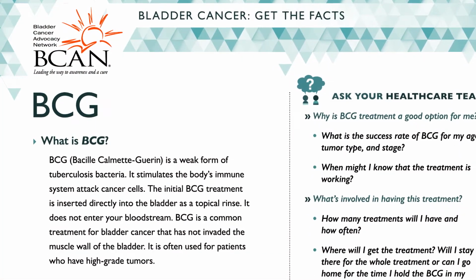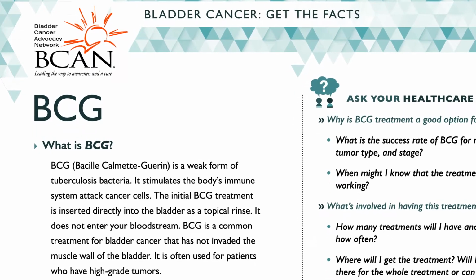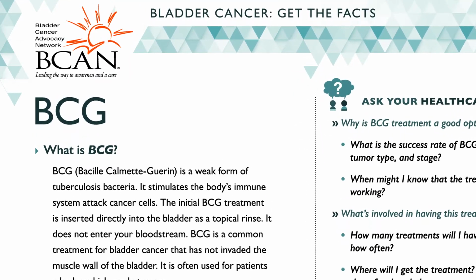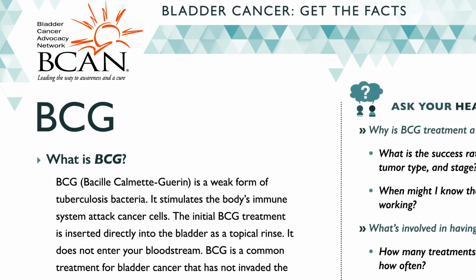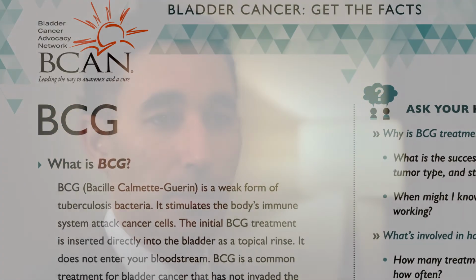So another important aspect of the study was that we had to wait a minimum of 6 weeks before instillation of Cysview for evaluation under blue light for patients who had undergone BCG therapy or any intravesical therapy. That's perfectly in line with what we do in clinical practice. Previously it was thought perhaps we need to wait 90 days or 3 months to let the inflammation settle down to decrease false positive rates, but fortunately we saw that 6 weeks was really an adequate time to wait, and it did not increase our false positive rates with patients who had undergone intravesical therapies. So that was important because it's perfectly in line with what we do in clinical practice.